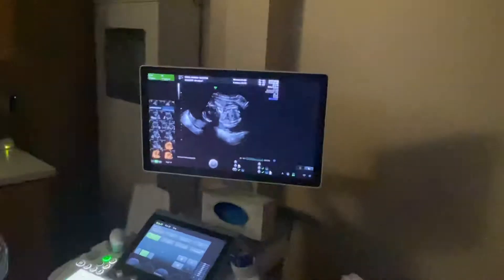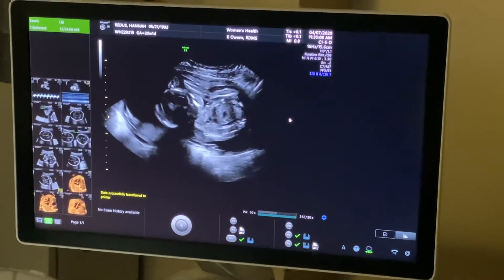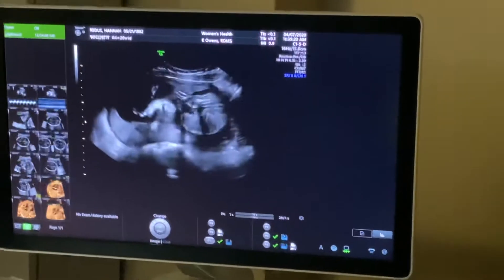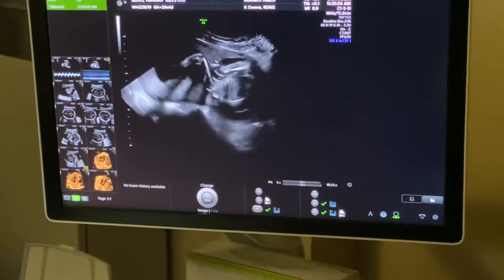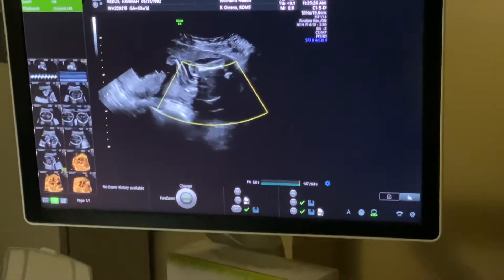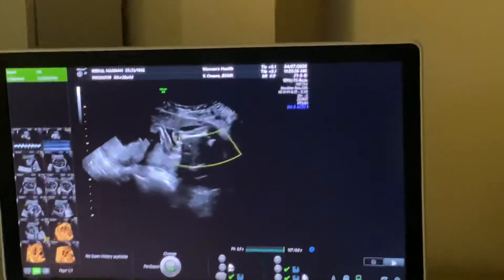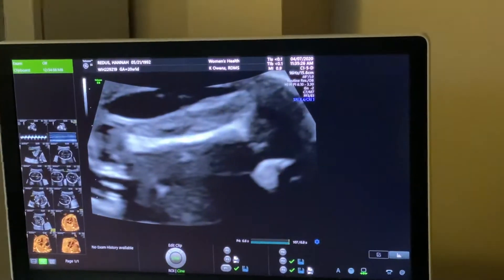Spine, leg, leg over and set. One of the things that we do is we measure the baby's leg. It's a lot smaller here, so we can get a measurement here. This is the baby's femur.